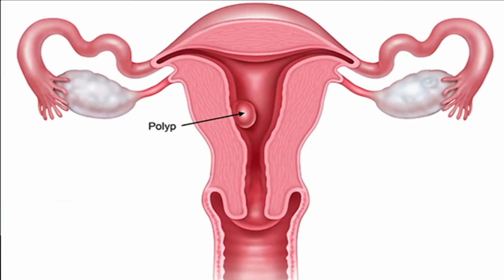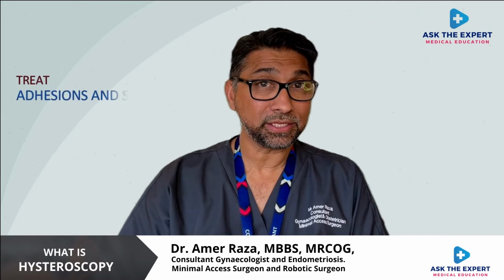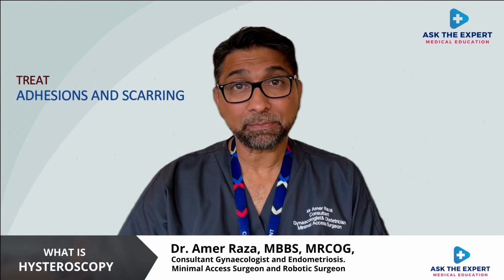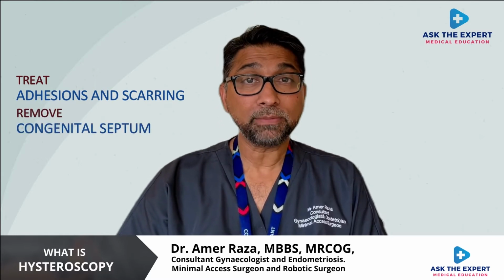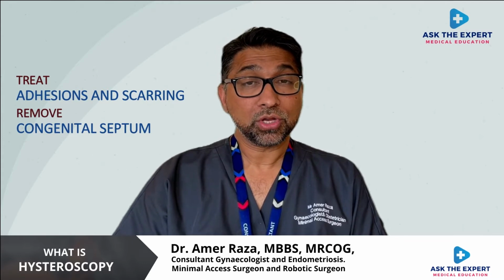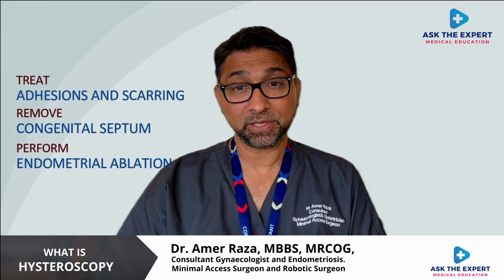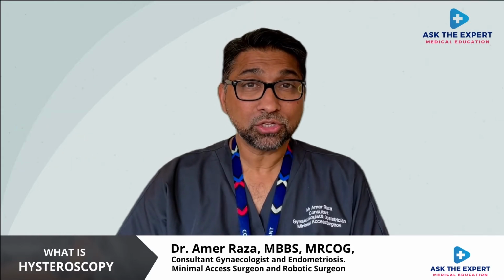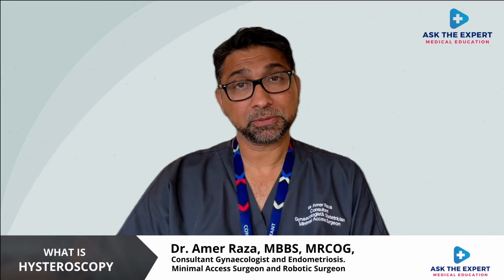The other big category for doing hysteroscopy is therapeutic, and that will include removing fibroids from inside the uterus, removing endometrial polyps, treating adhesions and scarring inside the uterus, and excising septums which develop due to congenital reasons. At times it is done to excise the endometrium lining to help with heavy periods, or endometrial ablations. Hence, hysteroscopy is part and parcel of every gynecology department.